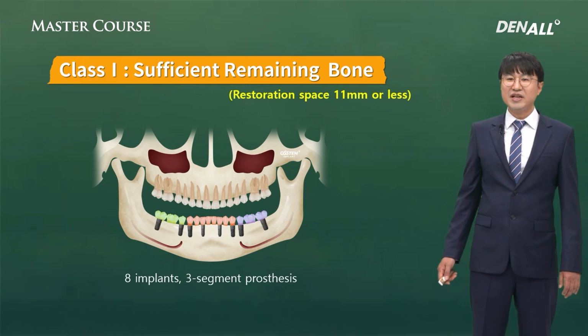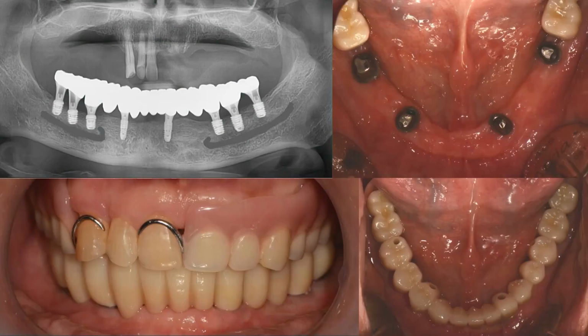On the anterior side, 4 implants were splinted, and the posterior split by 2, and restoration with 3 segments is also possible. For edentulous patients, bone is not always available in the place where I want.